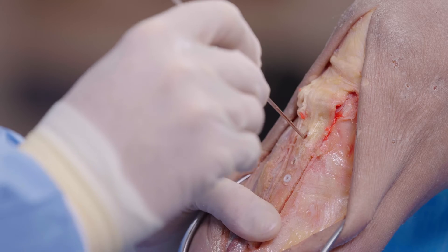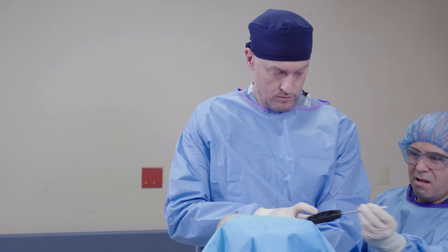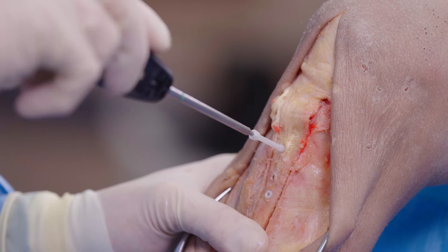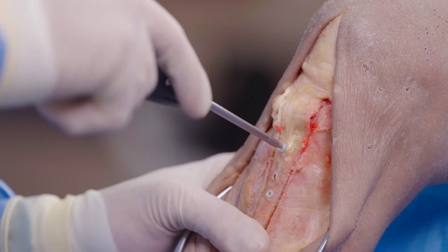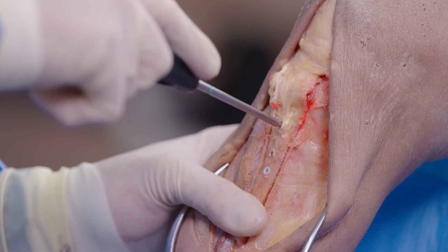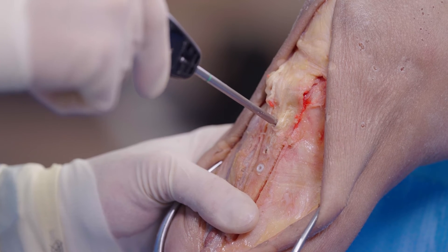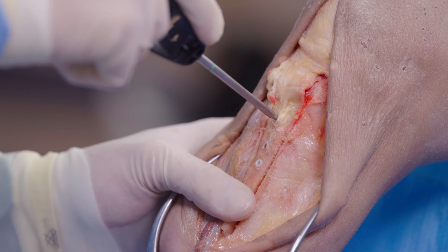You could place your K wire and go over the top with a cannulated screw, but in this instance we're going straight down. You can do this under fluoroscopy so you can see exactly where you're at and confirm the right trajectory. Now we're at the headless part and we're going to get that nice compression. And it's nicely countersunk — I'm about a millimeter under the surface, so that's not going to be prominent hardware.